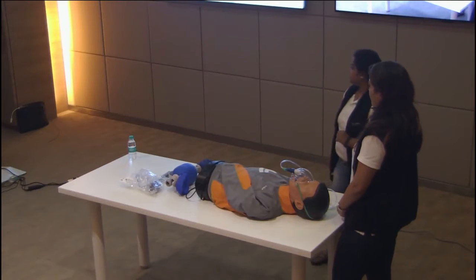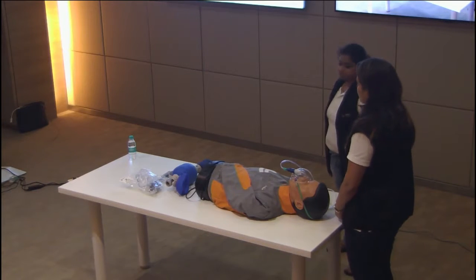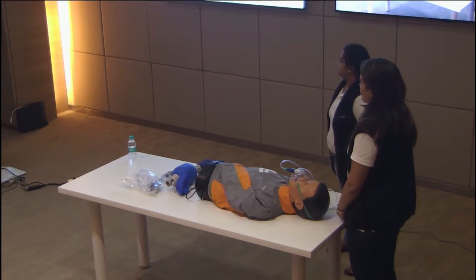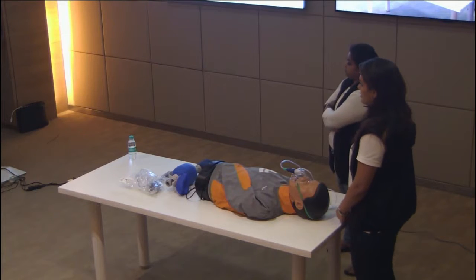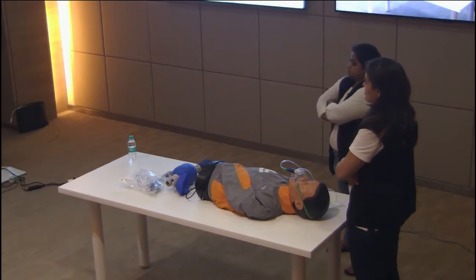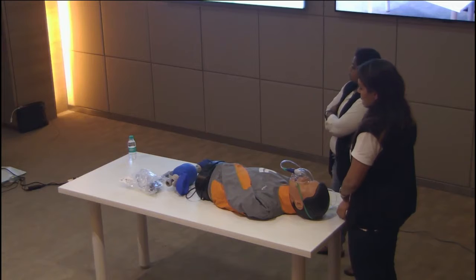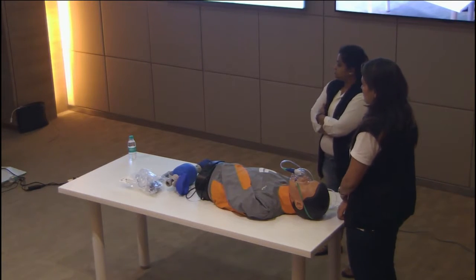So they have gone from starting with a nasal cannula, and they've reached a mask, and with the mask, the saturation still was less than 88, and then they decided to go to a non-rebreathing mask. Now, what is a non-rebreathing mask? It basically has two valves on the top and one valve down here. So whatever oxygen comes in first gets accumulated into the big bag down there, and that 100% oxygen gets inside, because of the respiratory flaps: if you breathe out, the air goes outside, whereas the air that comes in from the bag will fill up the chamber and make it 100% oxygen.